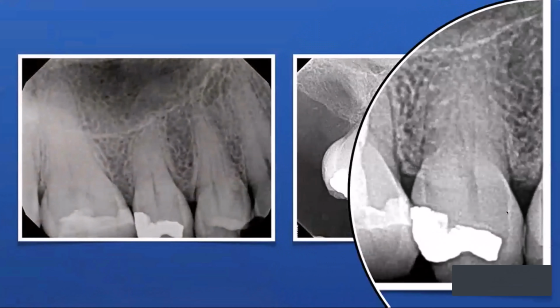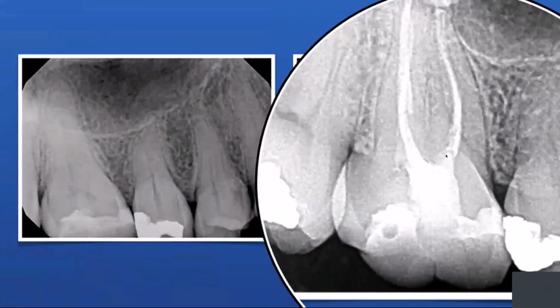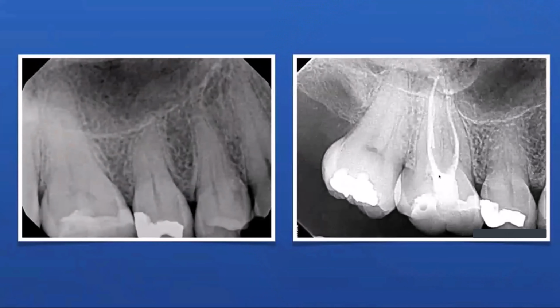Okay, and then I put a composite cap on. Move it into the anatomy, polymerize, and that's it. And then that's this case over here. So you can see the anatomy and the core is pretty clean. And this patient's ready to return to their dentist for a coronal restoration of a crown.